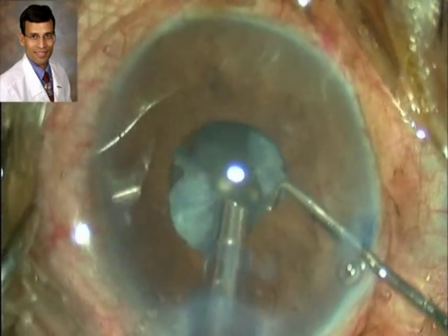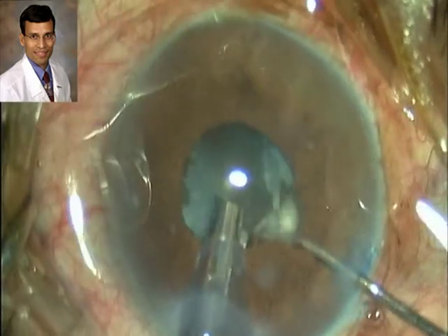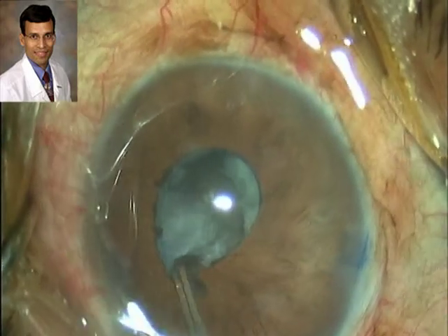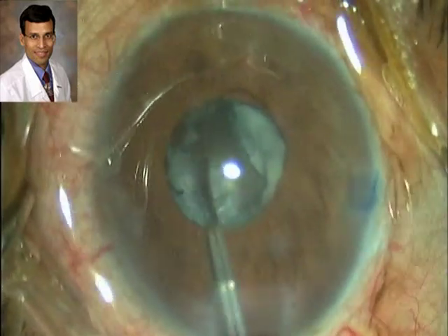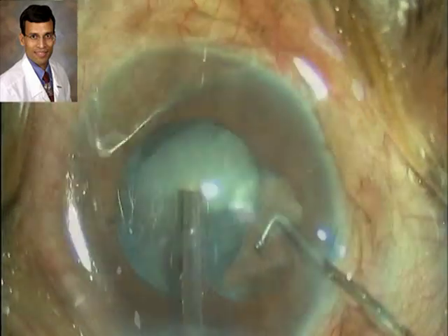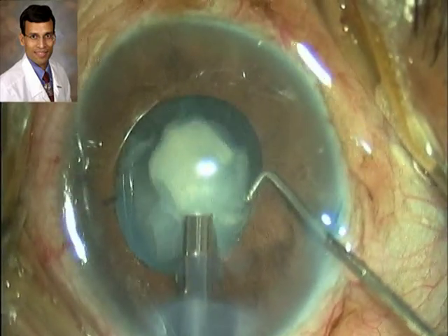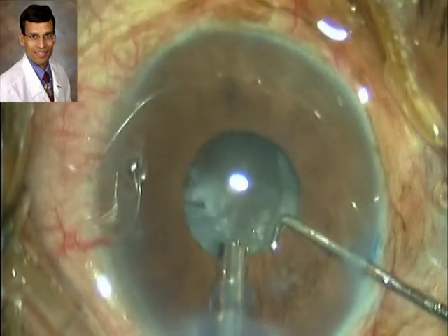Some of these cataracts may be partially absorbed, and the posterior capsule may also have pre-existent defects. Therefore, we need to be careful while performing the surgery and be specially gentle towards the posterior capsule. Nuclear rotation again needs to be careful, especially when a posterior capsule tear or dehiscence is suspected, and the movements should be gentle as compared to any routine case.